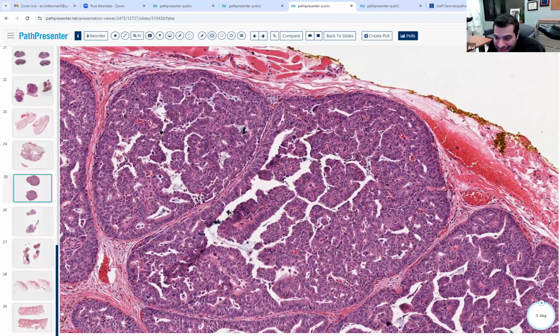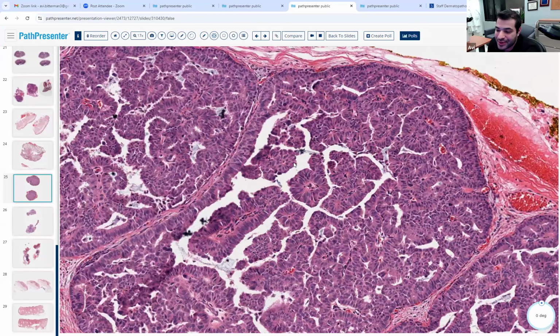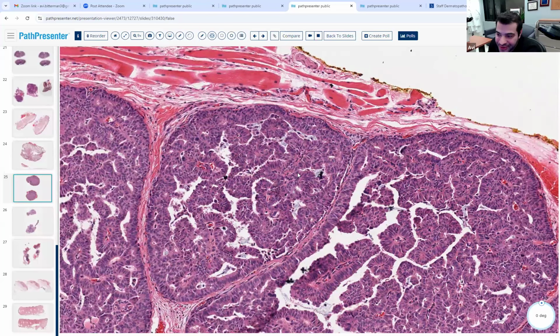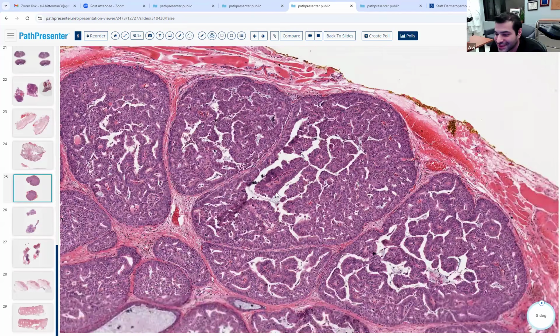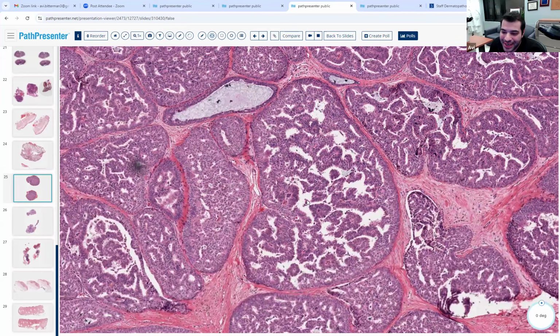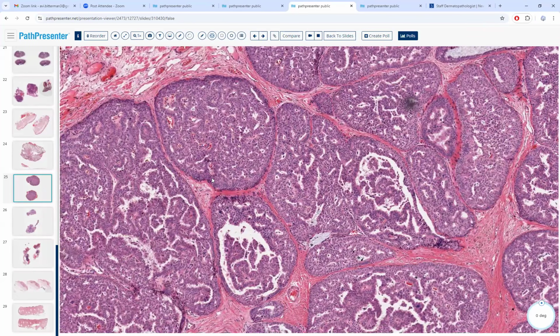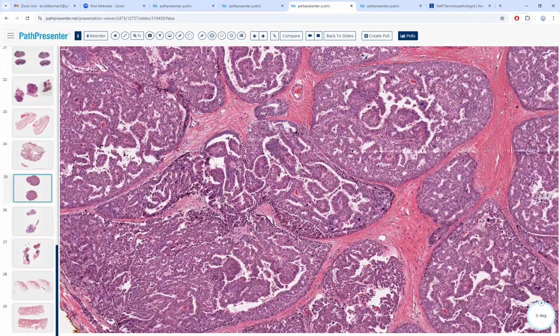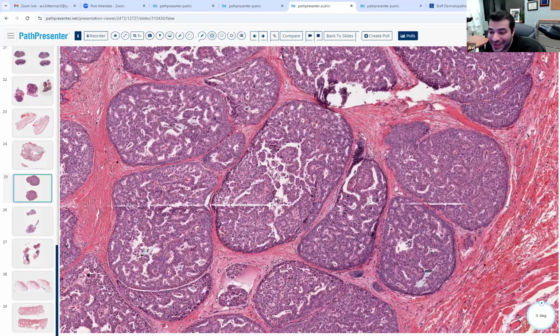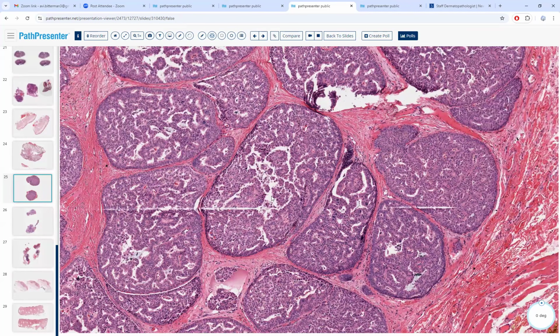There's another interesting thing about this. So other features you can see, as we pointed out, the pseudorosettes. Sometimes you can see a cribriform architecture to this. These stain very interestingly. Well, how do these stain? What kind of markers might EMPSGC stain for? Neuroendocrine markers. Like what? ER/PR. So ER/PR, well, that's not a neuroendocrine marker, but yes, they do stain for ER/PR. Synaptophysin, yes. Neurofilament, chromogranin, neuron-specific enolase, chromogranin.